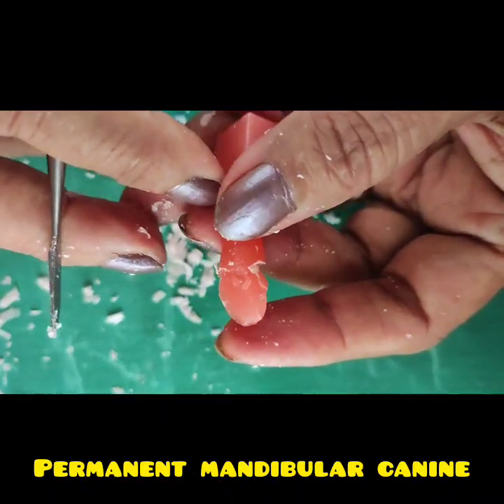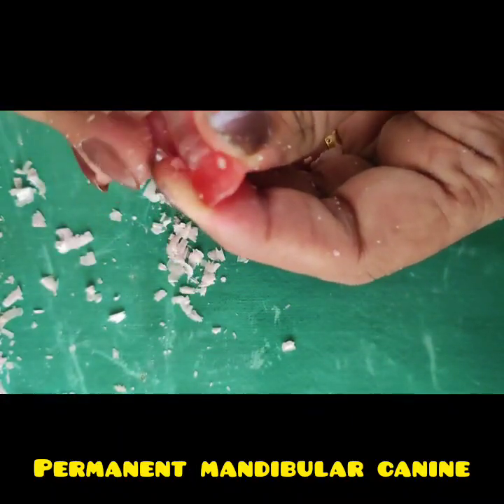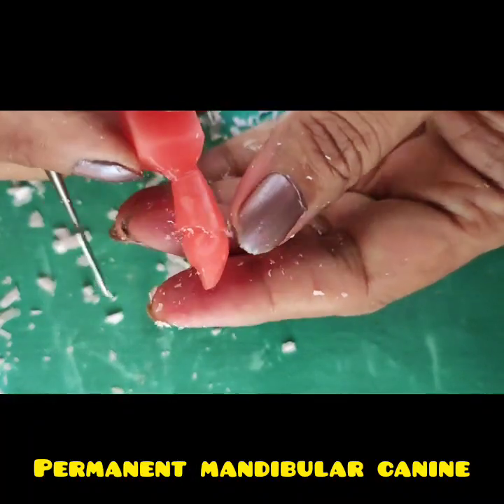The labial surface will become a nice U shape. Lingual also, we can reduce the lingual cingulum because it is not so prominent. This is how the cingulum is reduced.